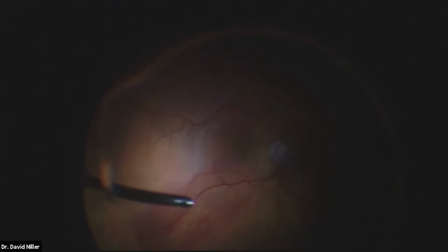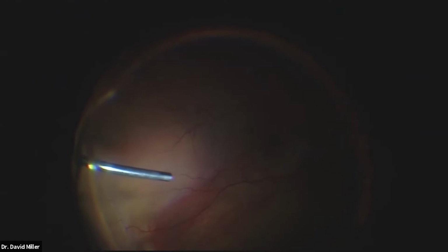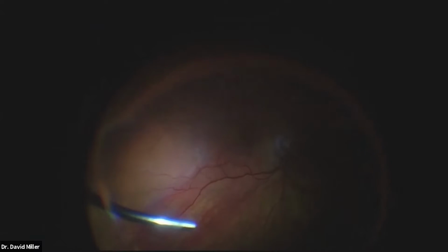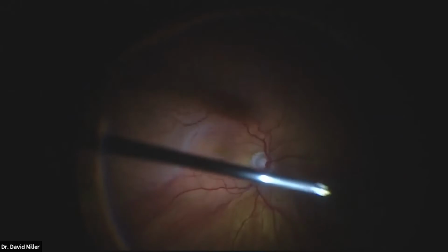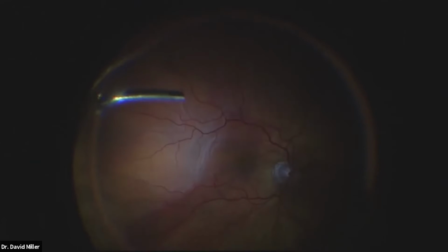And once we get a nice working space in here, we'll talk about things like identifying the retinal breaks, whether to shave the vitreous, get the traction off the tear, etc. All that's coming up. While we're just doing the vitrectomy here, I'm going to ask for an occasional question from Rachel, who maybe can take a look at the list of questions that are submitted or the live Q and A questions that are coming in as we're working here by the chat button on the computer. So Rachel, you have any questions?